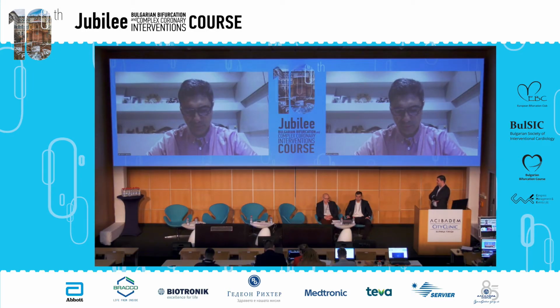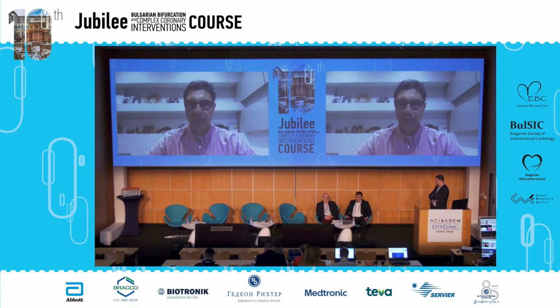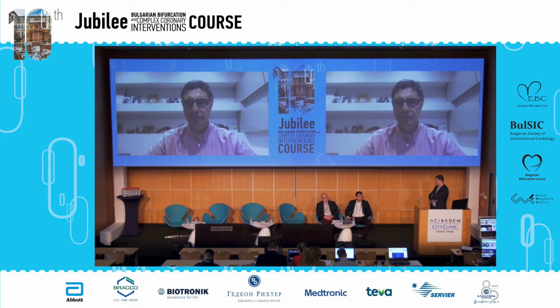That is really a very important comment, because what we know from practice is that there is usually a big thrombus burden. And we should not forget that this thrombus burden is treatable with pharmacological treatment. And this is something that we should keep in mind. Very often we leave some thrombus and not very good angiographical results, with some shifting of the thrombus into the side branches.